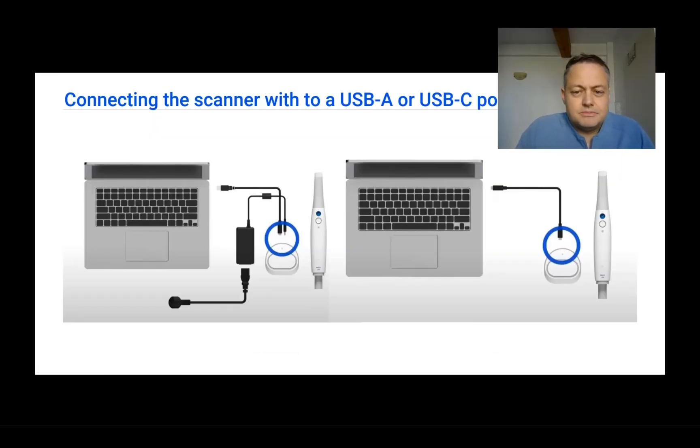After placing the tip on the scanner, it's time to connect the scanner to the computer via either a USB-A or USB-C port. USB-A ports do not deliver enough power to the scanner base to work properly, so if you're using a laptop with only USB-A 3.0, you will also need to plug the base into a wall socket — power comes from the socket while information flows through the USB-A cable.